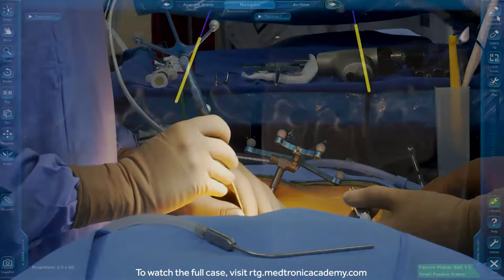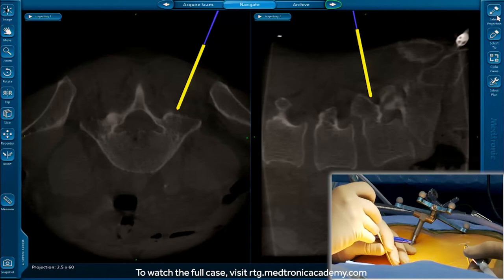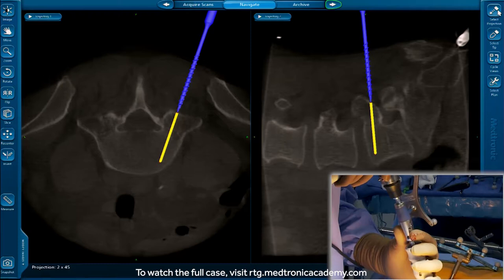There's a divot on the frame that we place it into, and we have a beep that tells us that it registered. All right, so at this point, we've registered our instruments. So now I'm looking down my pedicles at L5. If you look on the monitor, you can see that we have our trajectory. I'm docked over the L5 pedicle.